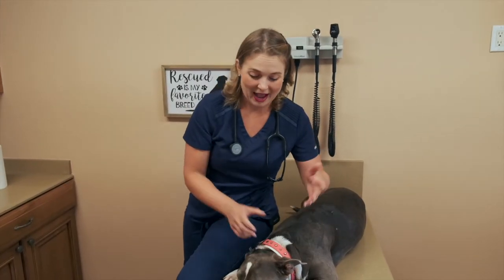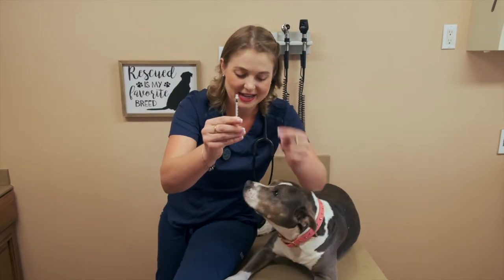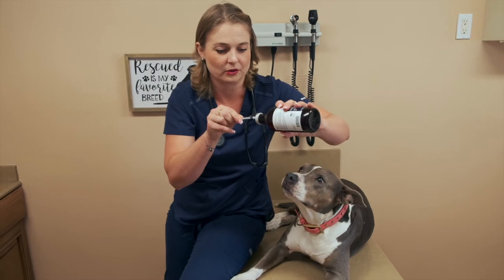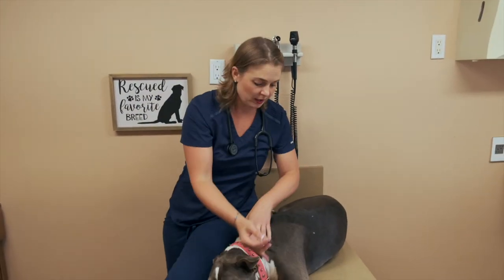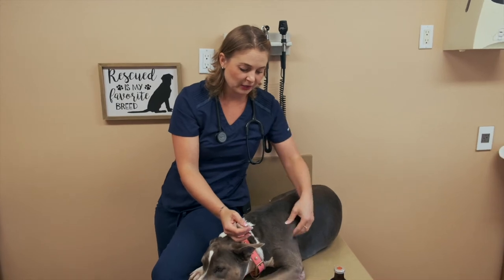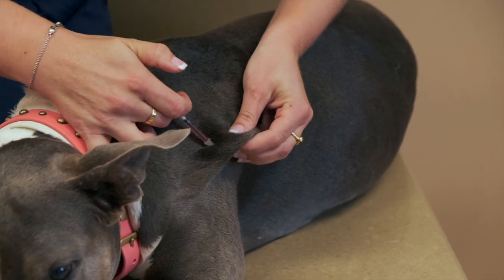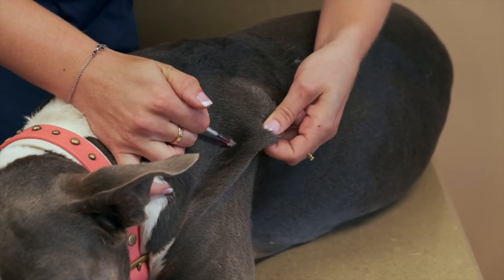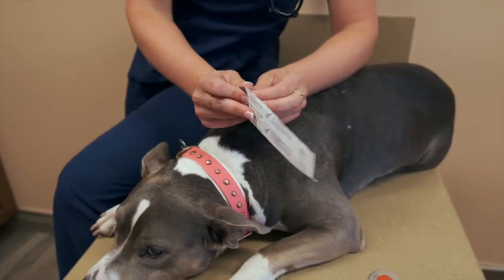Let's practice some more. I'm going to give her a shot of B12 — this is super harmless, but for the sake of this video we'll use it. We're using an insulin needle, which has the tiniest needle — it literally looks like a bee stinger. I'm drawing up some B12 and I'm going to give this to her in her shoulder blade. I pick up a little skin and inject right into it, pressing into the skin since these insulin needles are so tiny.